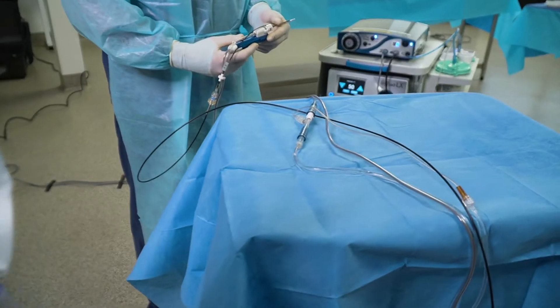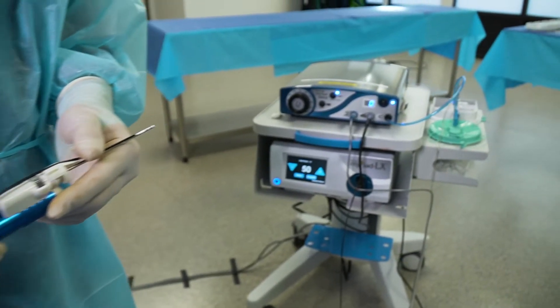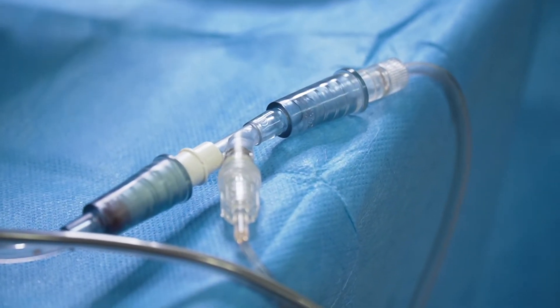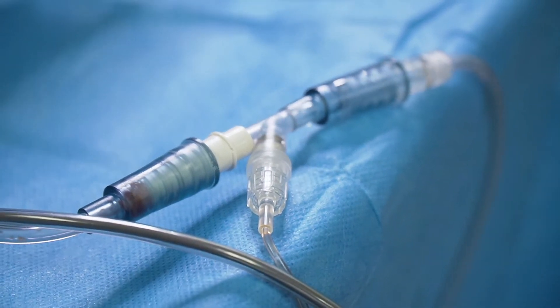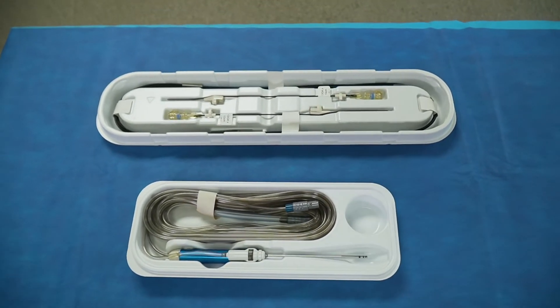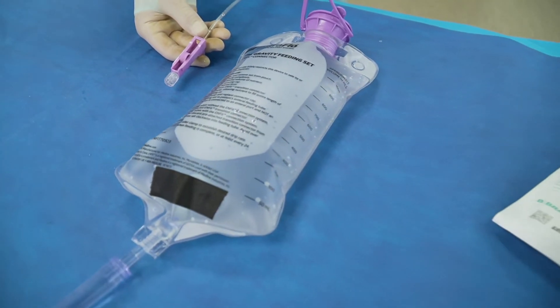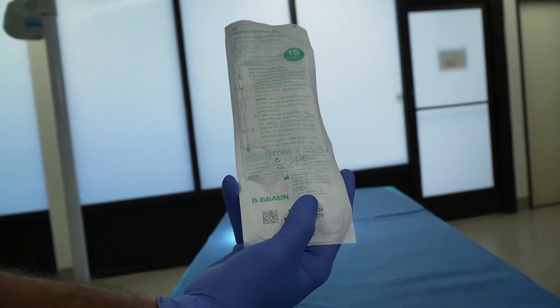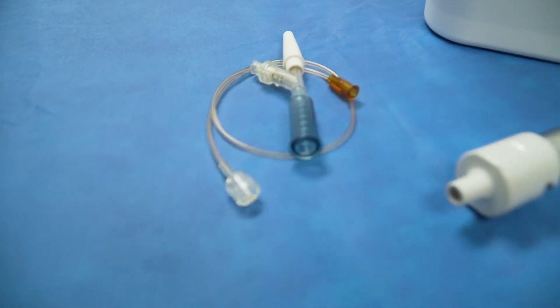Depending on your facility's objectives, there are a few ways the APS system can be set up. The intent of this option is to provide specimen collection and immediate refrigeration while mitigating the accumulation of clotted blood inside the collector. The necessary items will be: Myriad Novus with handpiece, APS pack, lactated ringers, sterile IV spike set, and additional specimen collectors or infusion valve sizes based on the goals of the procedure.